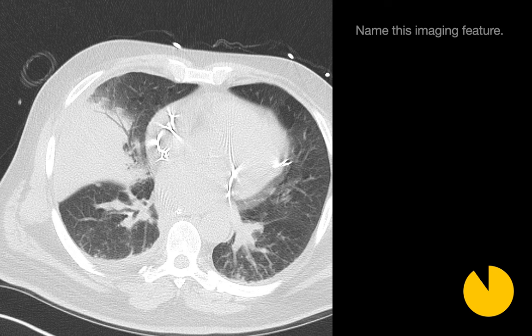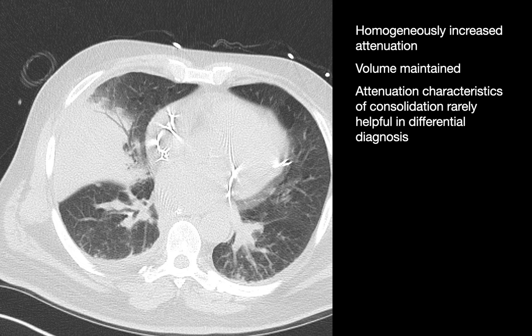Name this imaging feature — and the answer is not air bronchogram. We're referring to this large region of opacified, white-appearing lung. The volume of this area looks maintained; it does not look contracted like you might see in atelectasis or fibrosis. The answer we're looking for is just consolidation — a region of increased attenuation lung with volume maintained.